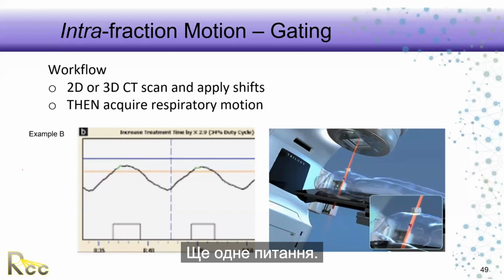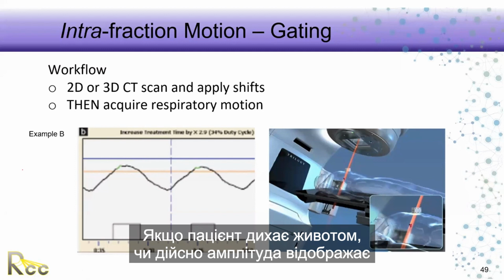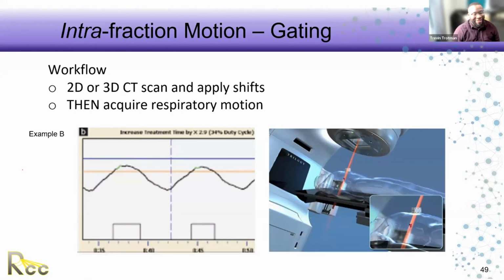Just one more question, Trevin, sorry. If a patient is a belly breather, this is a really good question. If the patient is a belly breather, does the amplitude really reflect the change in lung volume? That's like a whole research project right there, that question. Belly breathing.